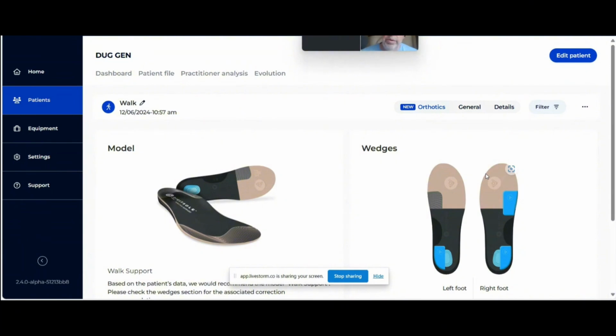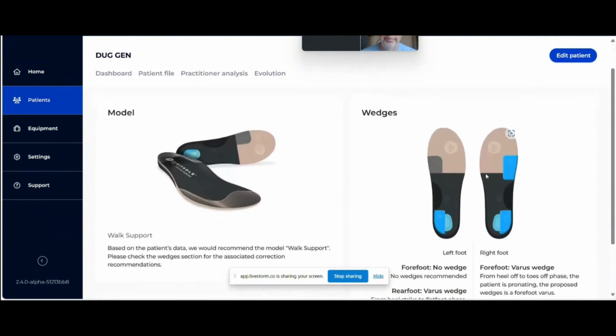So we can use the movement analysis to really support some of those. And again, correcting some abnormalities in their ground contact is extremely important anyway, especially if they do have peripheral neuropathy and they're at risk of wounds and falls, because correcting those things can be very beneficial.